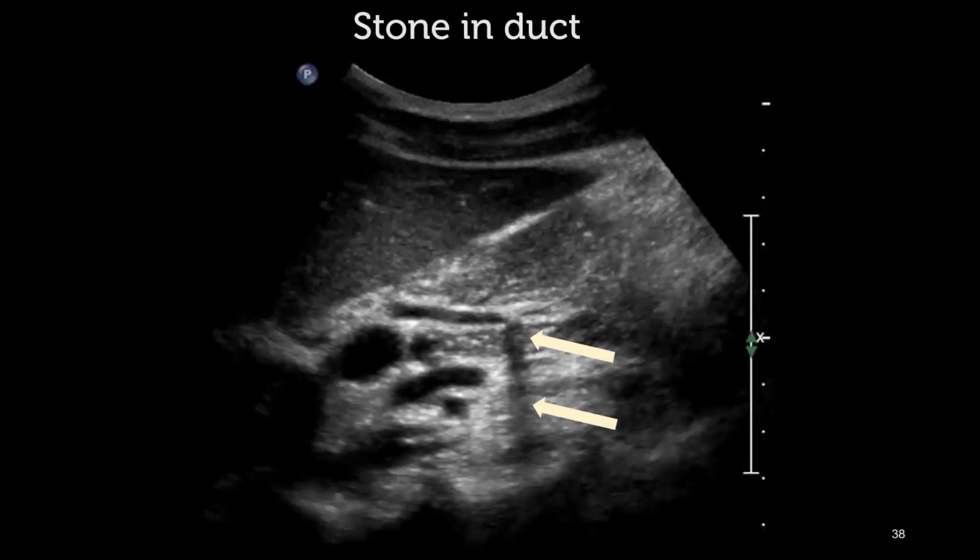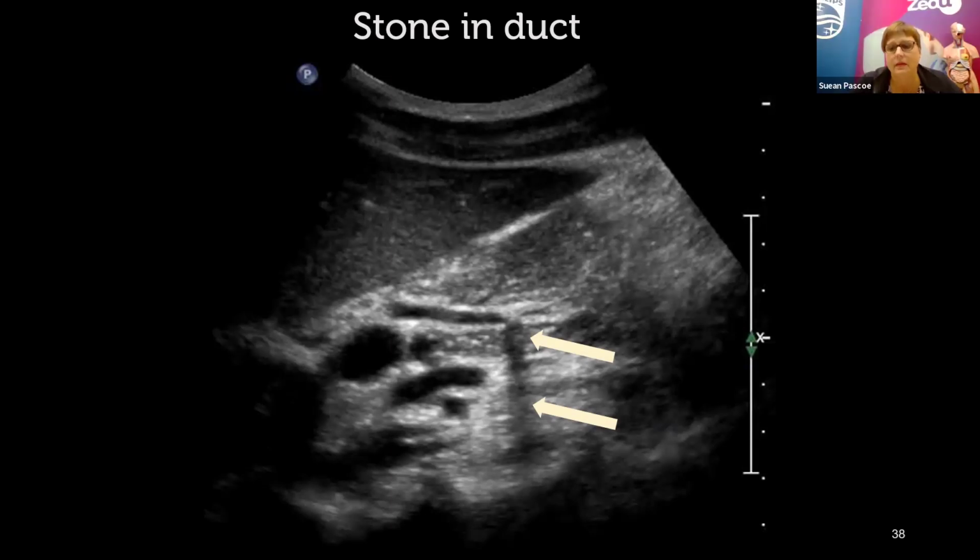And Sue-Ann, one view that's often useful too, if you can't roll the patient, is to start from a FAST view and look between ribs as well. Yeah. That intercostal view can be helpful, but again, like I keep harping on about this, you can't just pull out these extra views to assess things on the difficult patient that you can't get a good window on. You have to practice those views all the time and practice them on some really easy normal people first to be able to rely on your technique when you really need it. So practice scanning subcostally, but also have a crack at an intercostal view quite often too, so that you can have confidence in your technique when you need it.